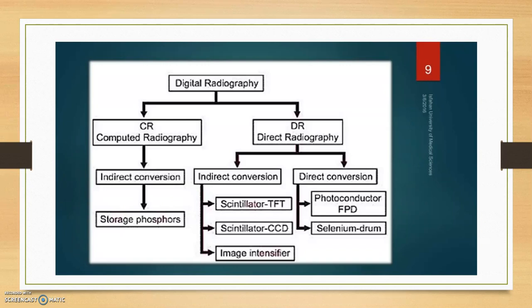So as for CR, it is still praised because of its retrofitting ability, how it's able to install onto existing hardware, existing devices, and upgrade to a newer CR system, whereas DR often cannot be retrofitted, and completely new hardware may have to be installed. And along with the new retrofitting function that DR is going to have, that is called automatic beam detection software, it contains certain elements such as gadolinium oxysulfide and cesium iodide. That helps with that.